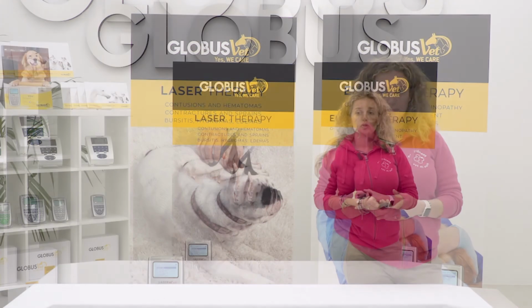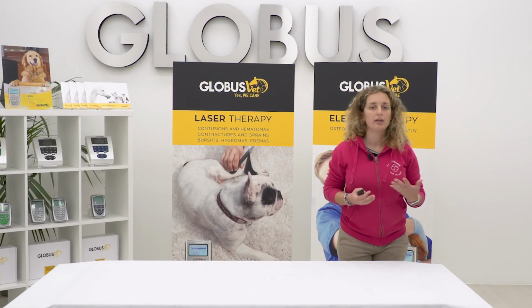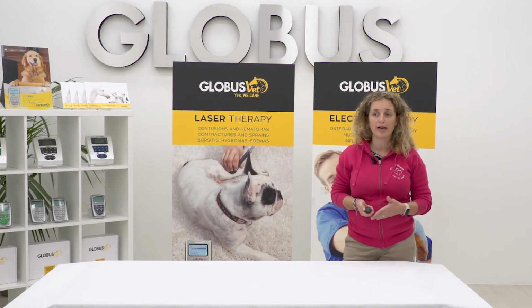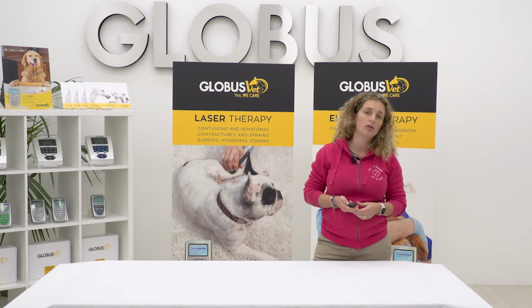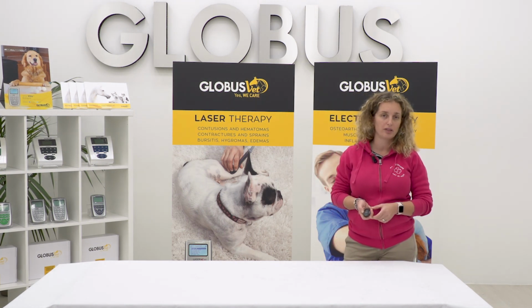After 10 treatments, we move on to 1 treatment per week. There is no more lameness, so we also remove the laser on the carpus. Lipo at home is no longer required to rest. As you can see, he no longer limps, so he is a happy dog again, free to do whatever he wants, to be able to age peacefully.